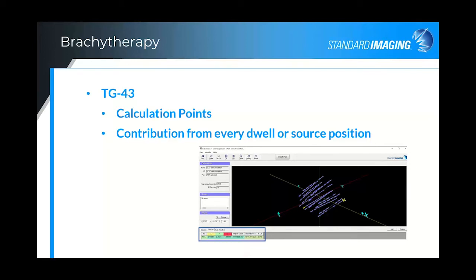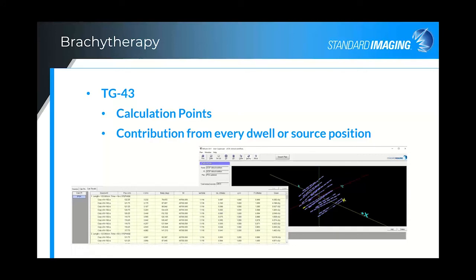And one can, of course, import multiple points to calculate dose, but in this particular plan, we have one calculation point. And I can show a bit more about this in the software demo, but one can see every source position, as well as the dose contribution from that particular point.